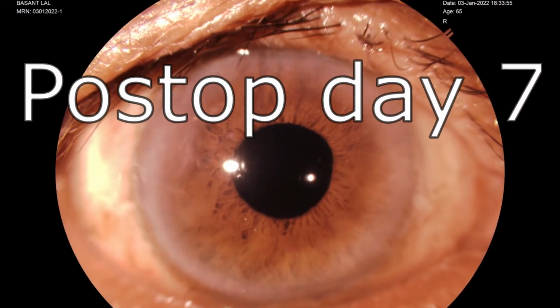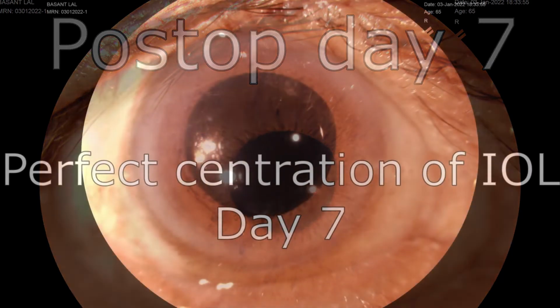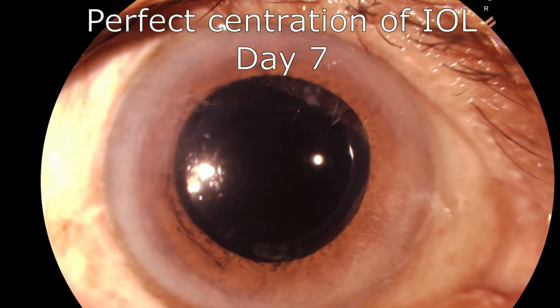But post-op at day 7, the cornea is clear and the vision is 6/9, and in the dilated state we can see the IOL is nicely centered and media are clear.